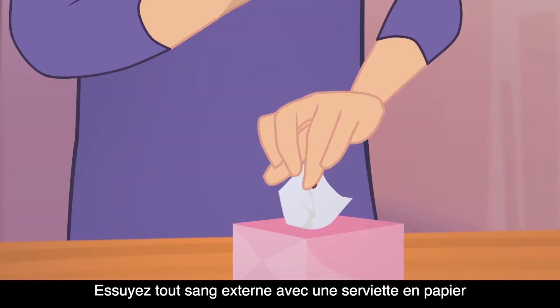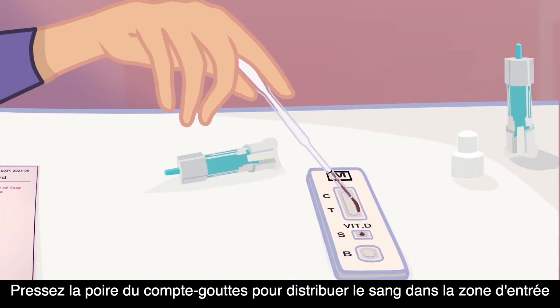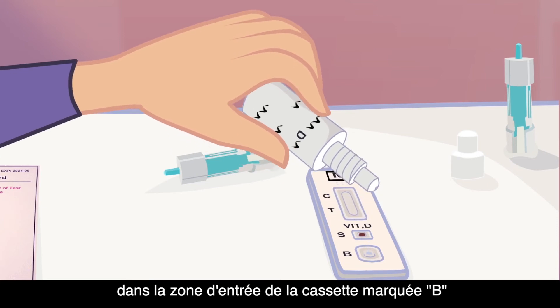Wipe away any external blood with a paper towel or alcohol wipe. Squeeze the dropper bulb to dispense the blood to the entry area of the cassette marked S. Add two drops of the buffer to the entry area of the cassette marked B.